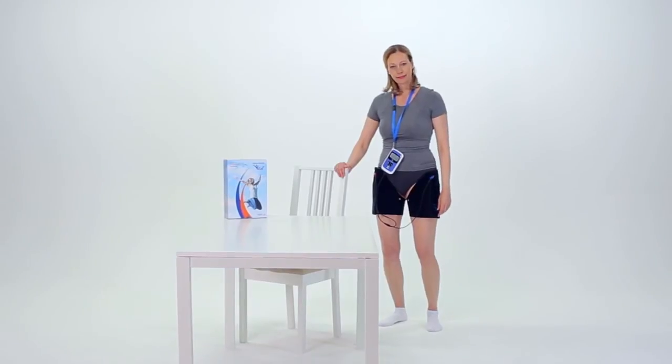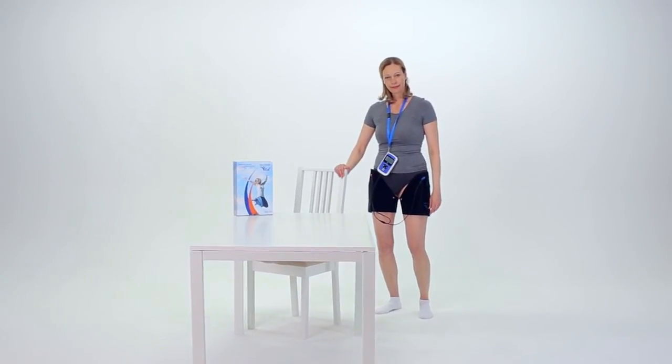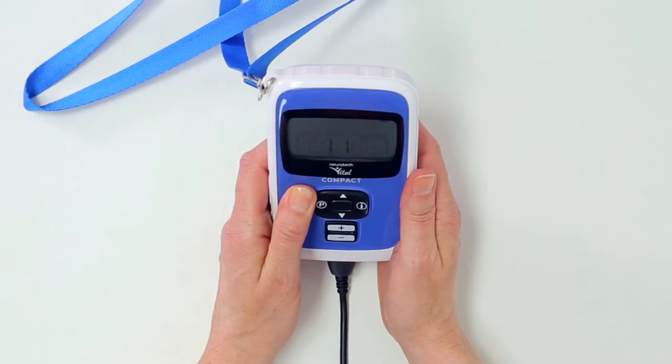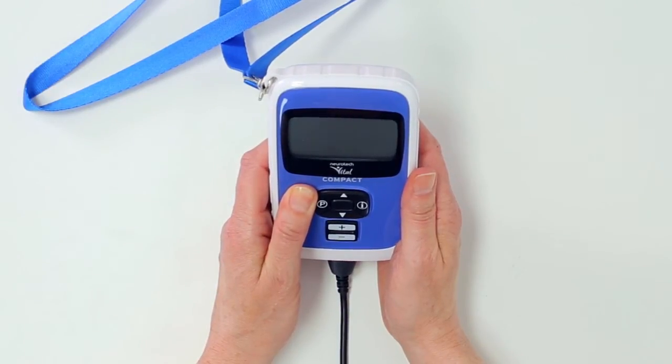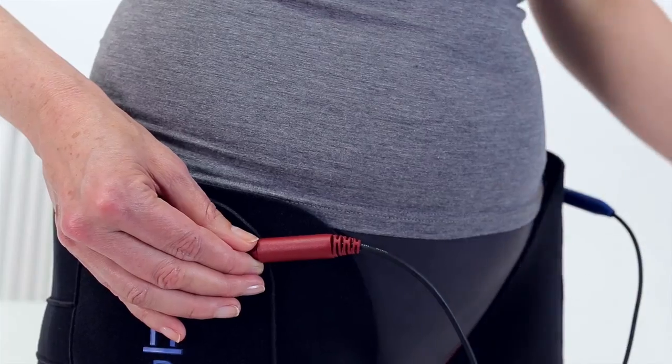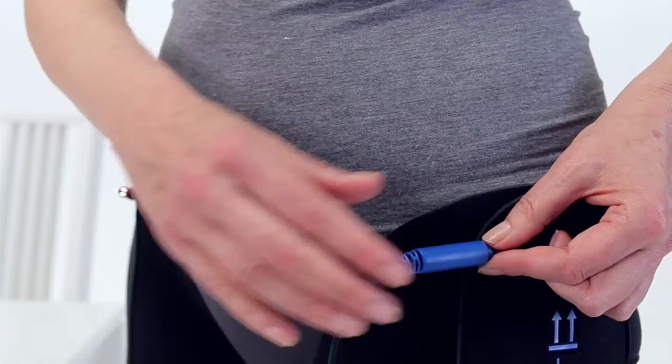The treatment session is finished when the counter on the screen reaches zero. The controller will beep to indicate this, and stimulation will stop. You can now turn the controller off by pressing the on-off button for two seconds and remove it. Then disconnect the lead from the right and left garments.